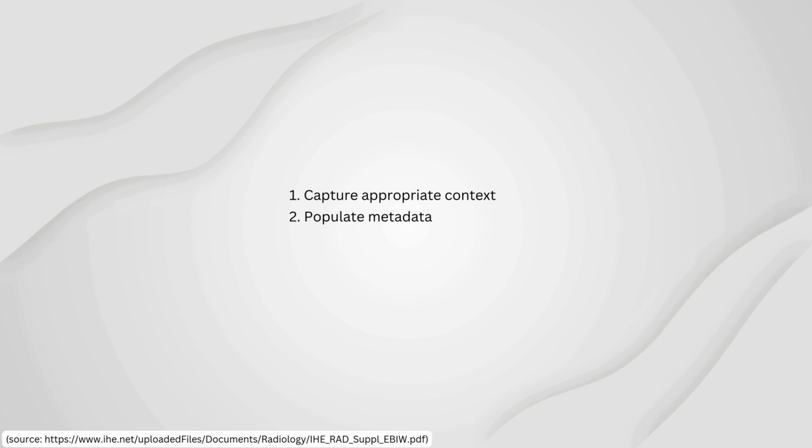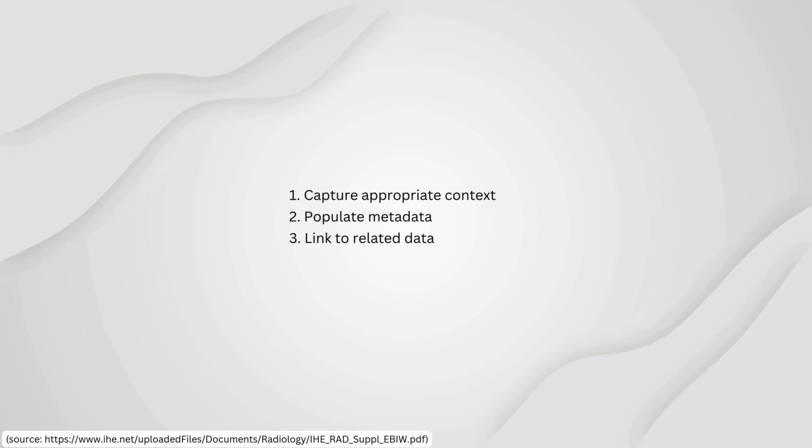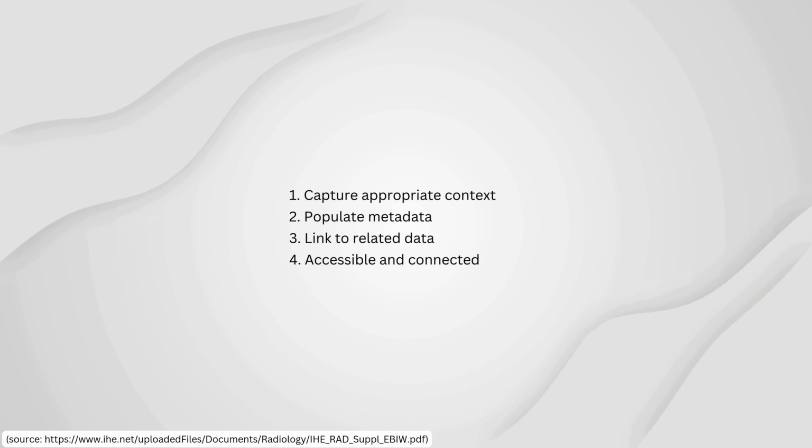So EBIW gives us the kind of workflow that we need to take what works amazingly in radiology imaging and bring that into the enterprise imaging world. Let's see how that works. The EBI profile is straightforward, specifying how to capture appropriate context, populate relevant indexing fields, link to the related metadata, and ensure that images are accessible and connected into the medical record.